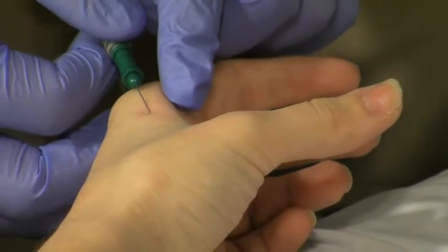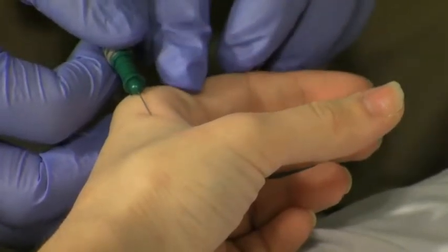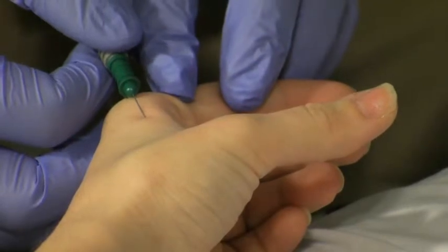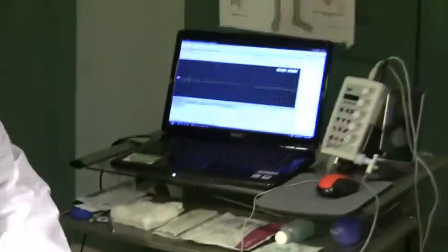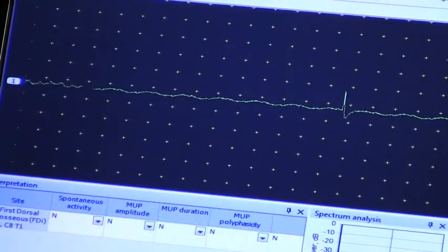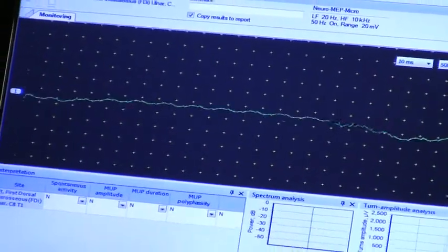Insertion activity in different directions to make sure that I'm not missing any muscle fibers that lost the nerve supply. Now I want you to watch the screen to see when I do the insertion what it looks like. Here we go. Insertion. You feel this. And then it stops.